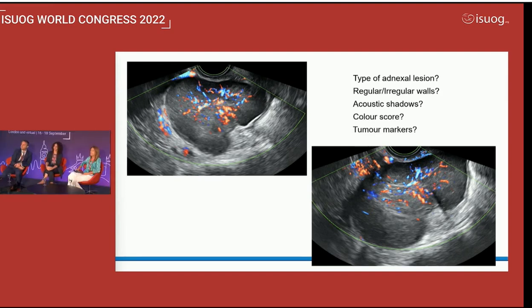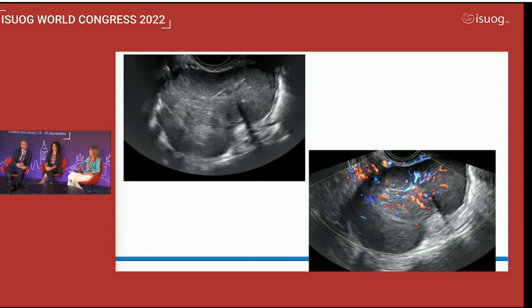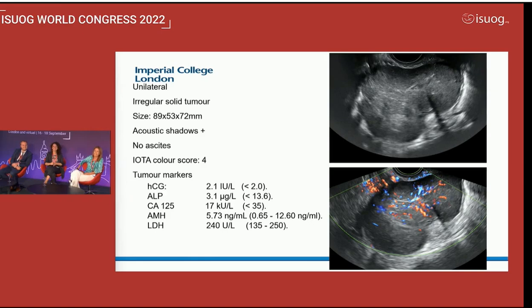I'd say quite malignant. And from your lecture, I'd say a dysgerminoma. Dysgerminoma. Wow. We will see. Let's check. It's unilateral. Are you really satisfied? I'm satisfied. Yeah, please go ahead. It's malignant. Let's check.